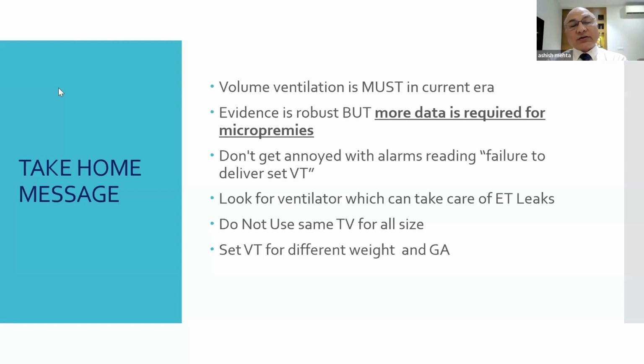And to tell the truth, how much percent of the babies do you need to put on high-end ventilators? Very small, very few. In fact, invasive ventilation is mainly for 800 to 1200 gram babies. We're talking about non-invasive ventilation. It is very small, those who require this kind of sophistication. So I am just targeting the audience that I'm talking to.